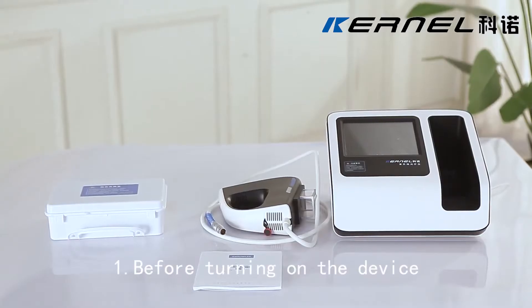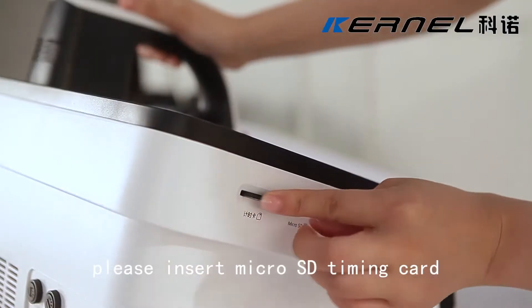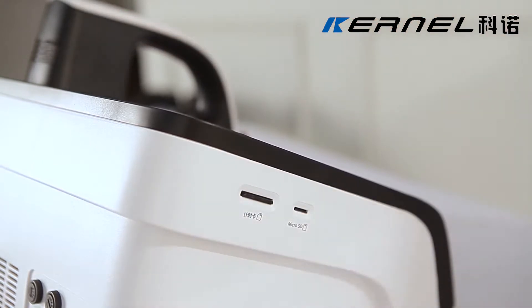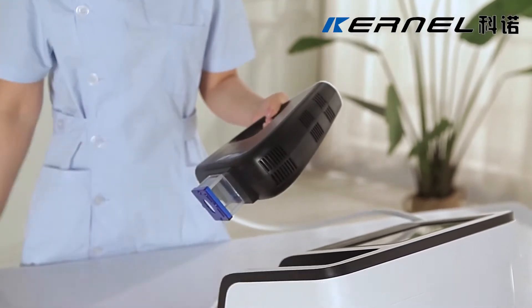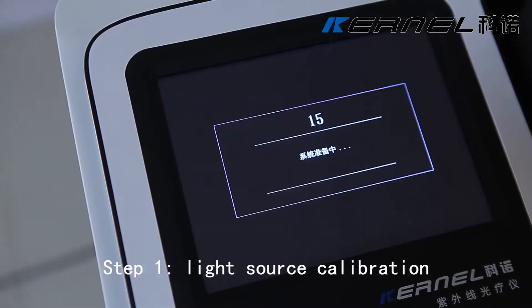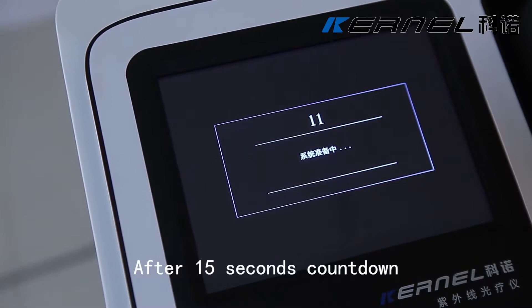Before turning on the device, please insert the microSD timing card and data card into the corresponding card slot. Select the appropriate hood according to the patient's different lesion.